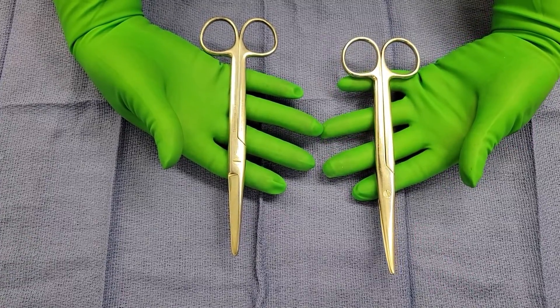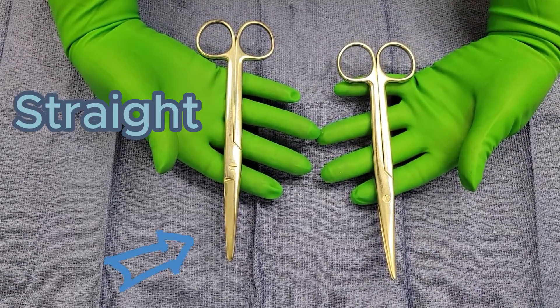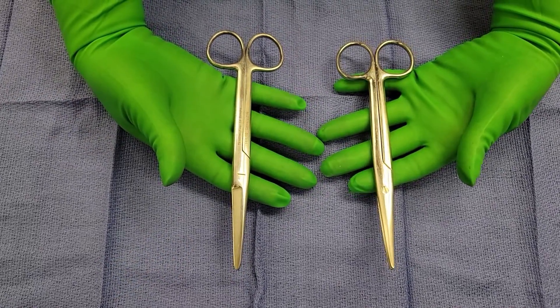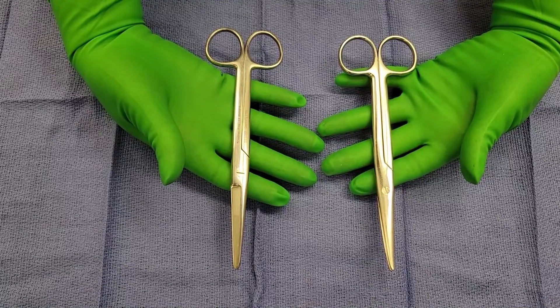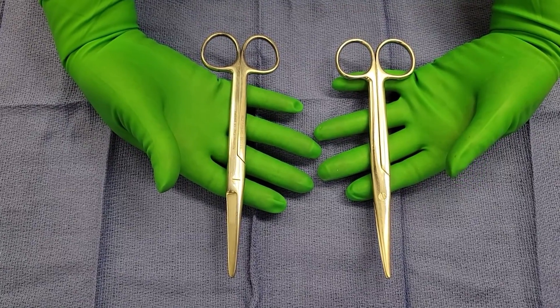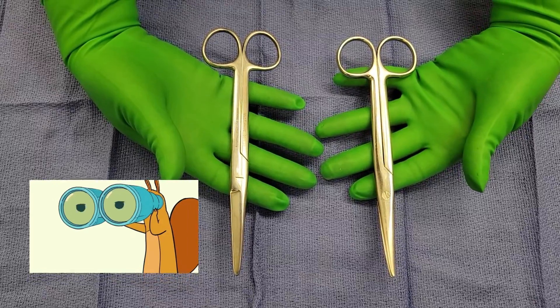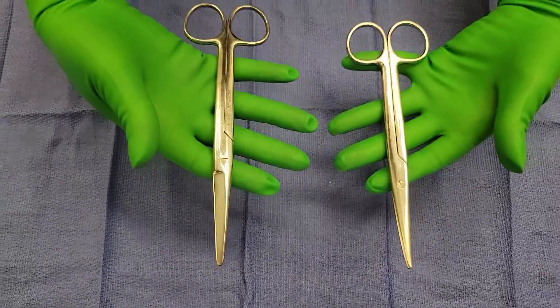Whereas if they were suturing, they may ask for a heavy Mayo or a suture scissor, and you would give them the straight one. You can always clarify with your doctor whether they want the straight or curved Mayo, but it's really important that you're paying attention to what is happening in the surgical procedure to help guide you.